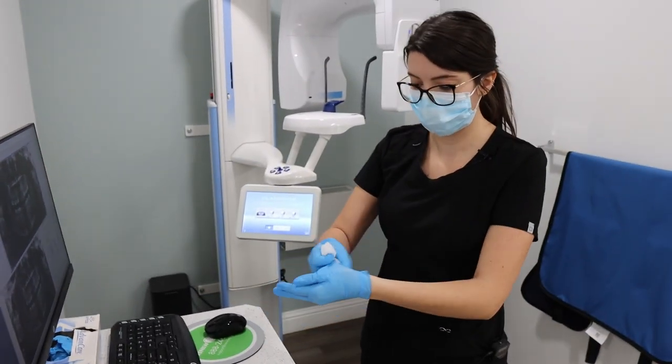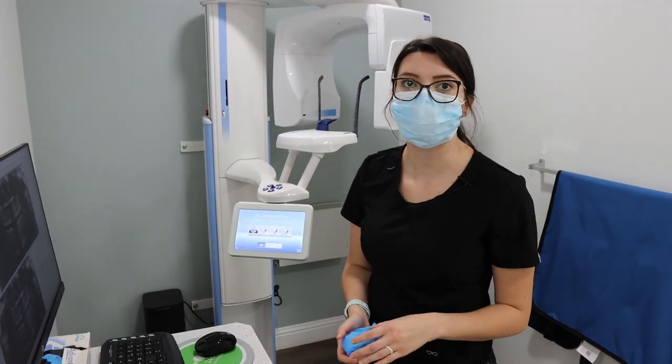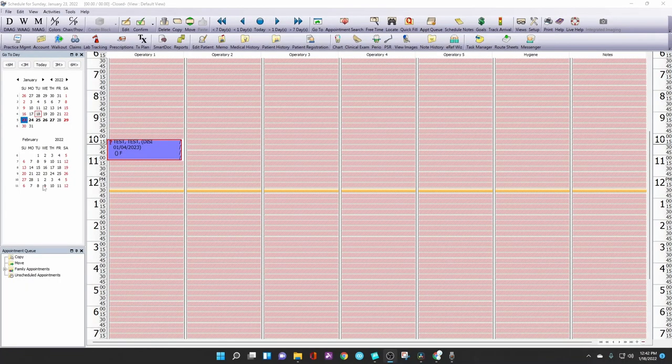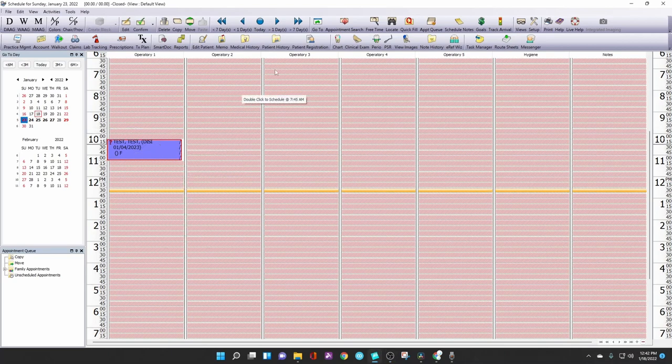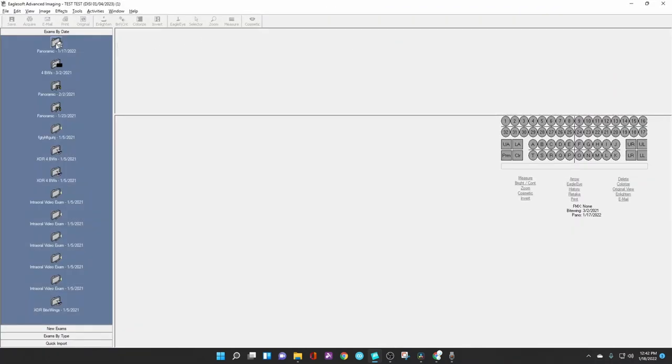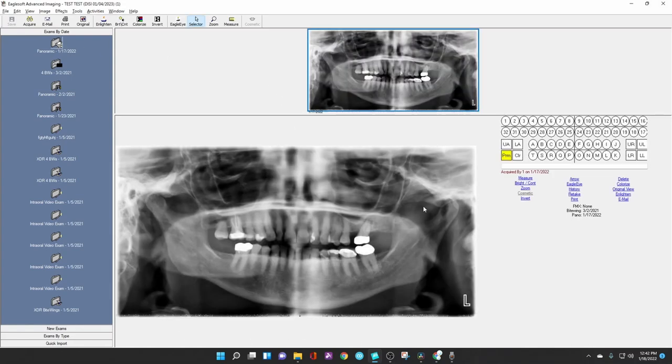You're then going to deglove and go back to the operatory to pull the pano up for the patient. When you go back into the operatory, you're going to select the patient and click on view images. You'll open up the most recent pano that you just completed and call the doctor in to look at the pano.